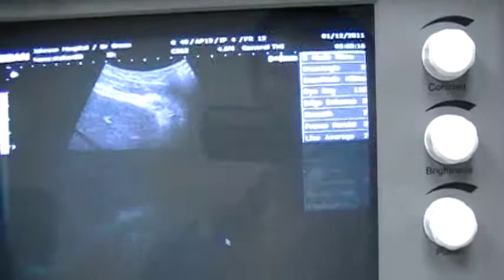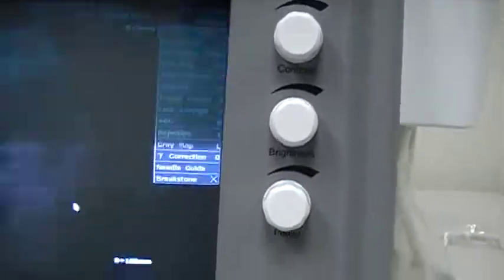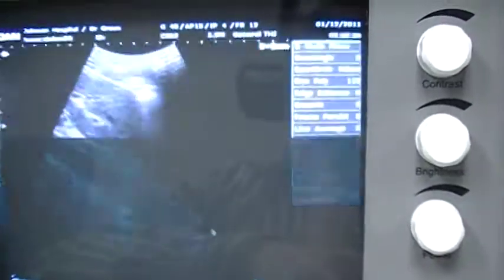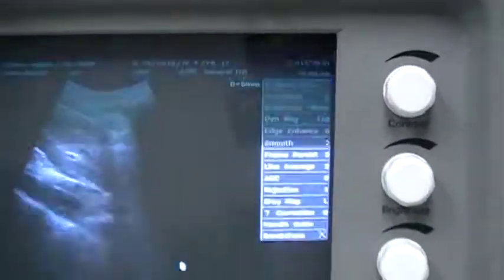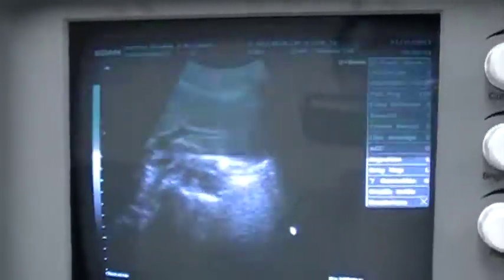Now we start to scan pictures — I am scanning my liver. To get a better image, we can see the current image is not good. We need to adjust the frequency; currently it is 4 megahertz. You can adjust it: if you are scanning a deeper organ in the body, you need to use a lower frequency.